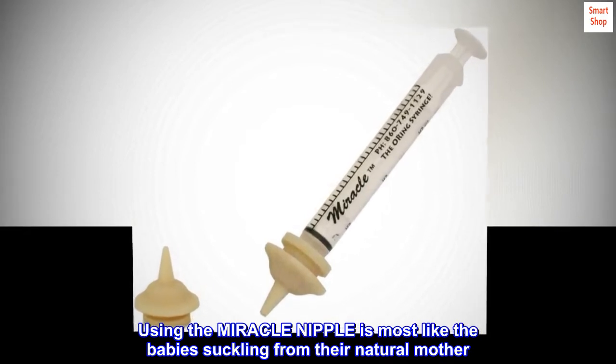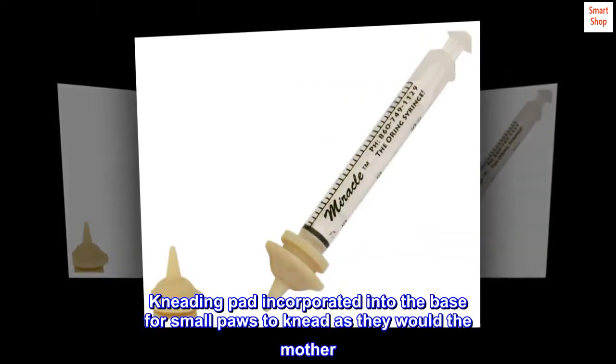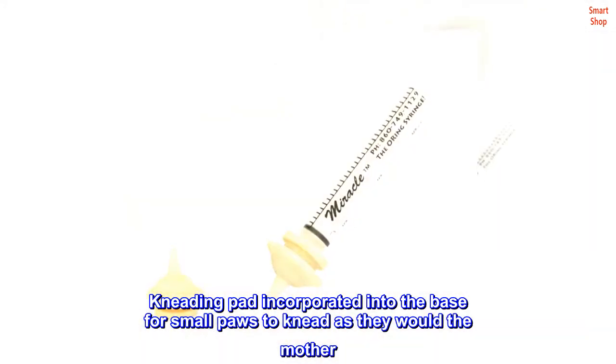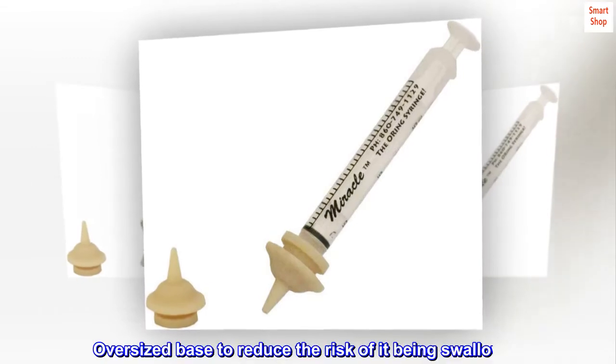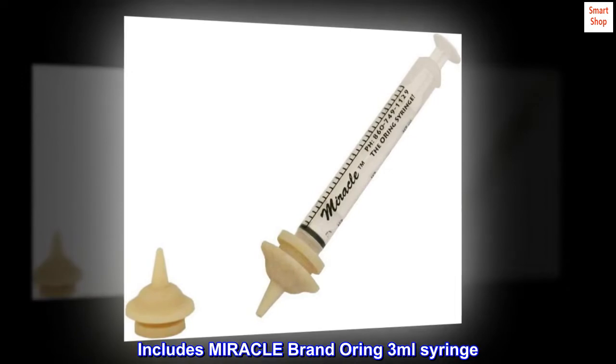Using the Miracle Nipple is most like the babies suckling from their natural mother. A kneading pad is incorporated into the base for small paws to knead as they would the mother. The oversized base reduces the risk of it being swallowed. Includes Miracle Brand 3ml Syringe.